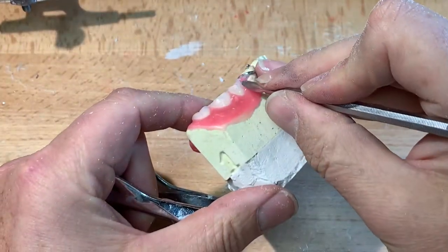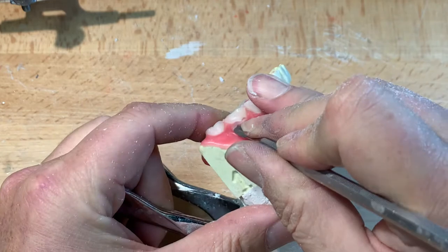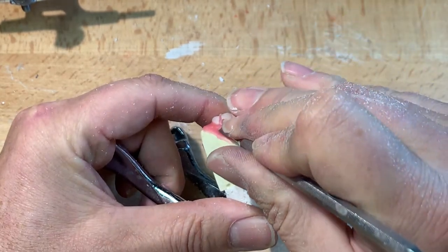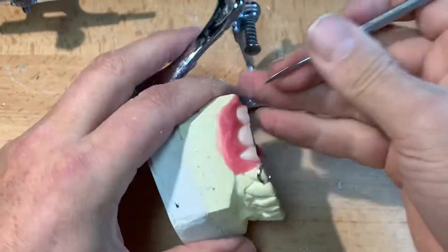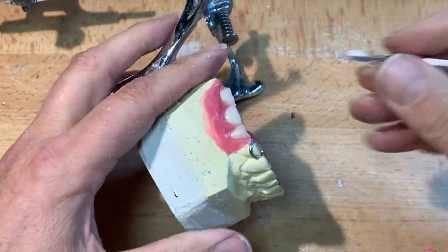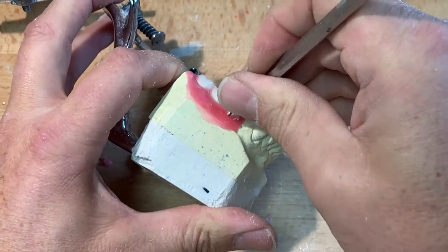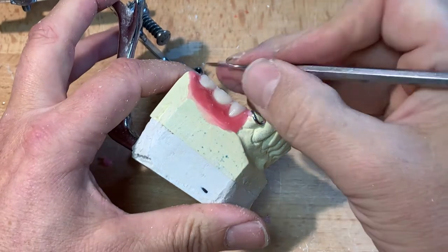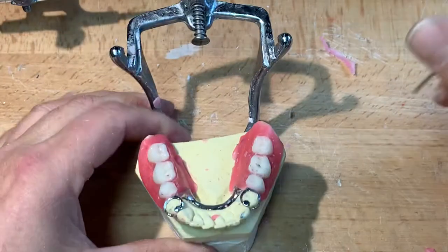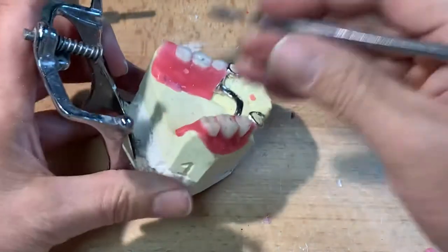I wouldn't carve the wax gingival margin in one fell swoop. I usually go back and forth three or four times, each time elongating it slowly so as not to cause the wax to crack or split. Here I've gone a little bit too low on the back one. This side was a little trickier to set up — number five almost ended up a little end to end — to simulate the same occlusion that was on number four, then work my way back slightly inside the ridgeline on number seven, maintaining that class one relationship.